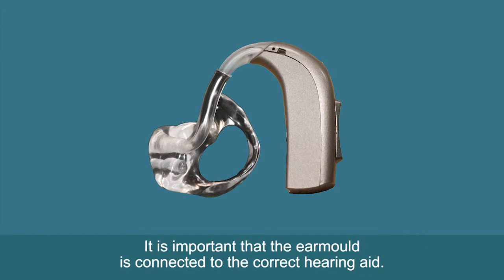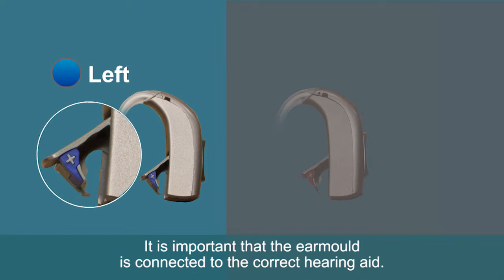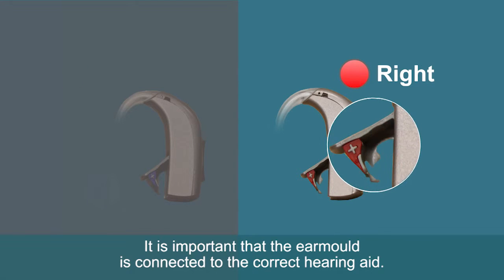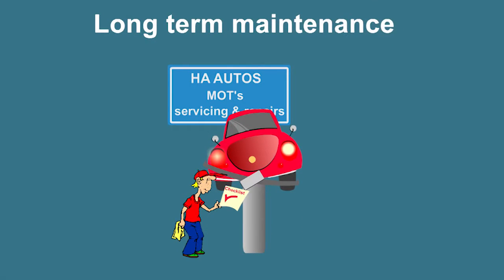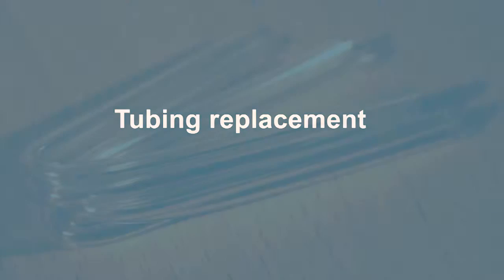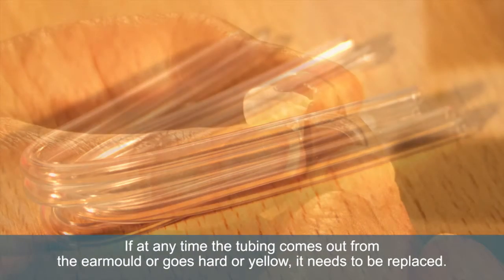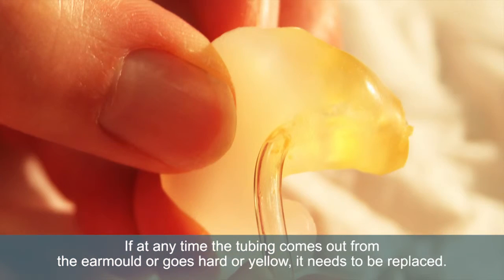It is important that the ear mould is connected to the correct hearing aid. It is important to replace the ear mould tubing about every 6 months to prevent problems arising. If at any time the tubing comes out from the ear mould, or goes hard or yellow, it needs to be replaced.